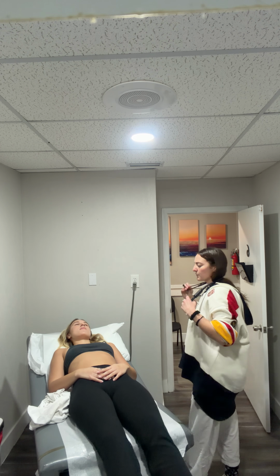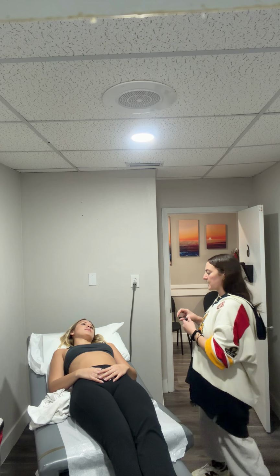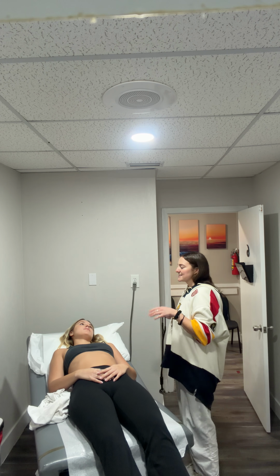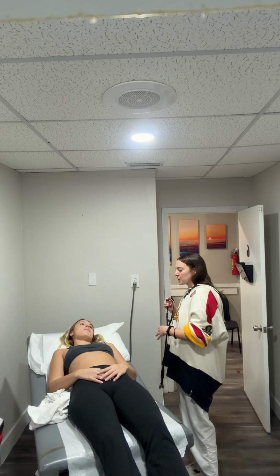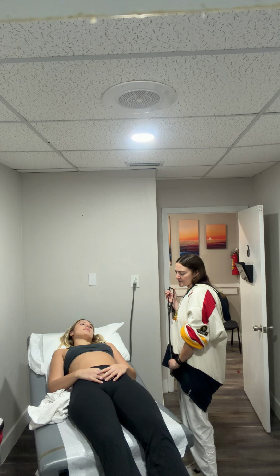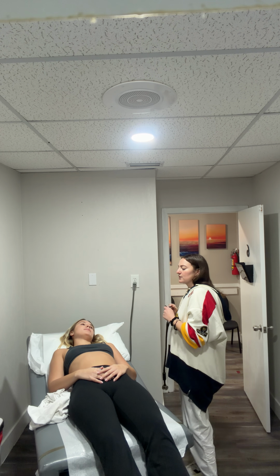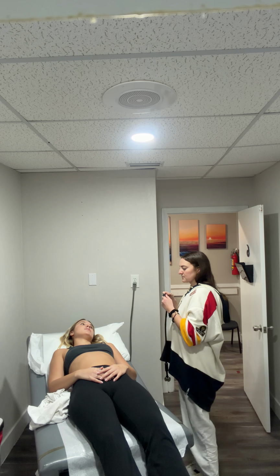All right, and now we're going to move on to auscultating in those same 5 spots, noting the intensity of S1 and S2, while also palpating her carotid arteries at the same time to differentiate between the 2. And then I'm also going to listen for S3 and S4, any murmurs, rubs, or gallops.